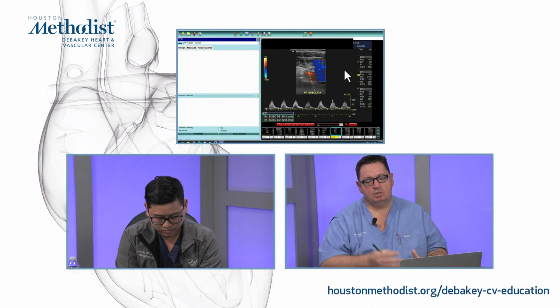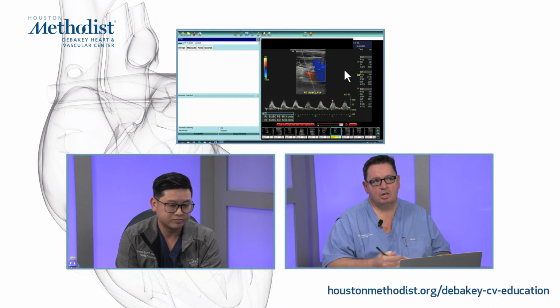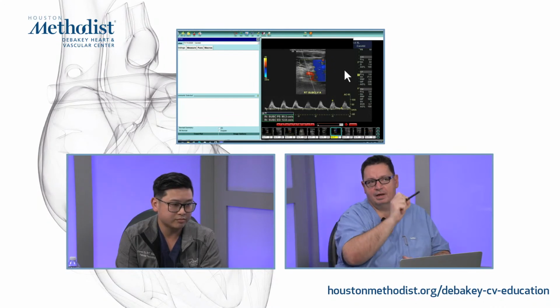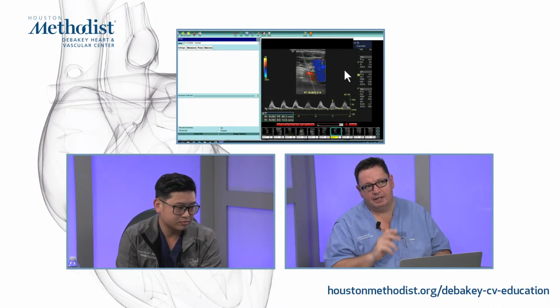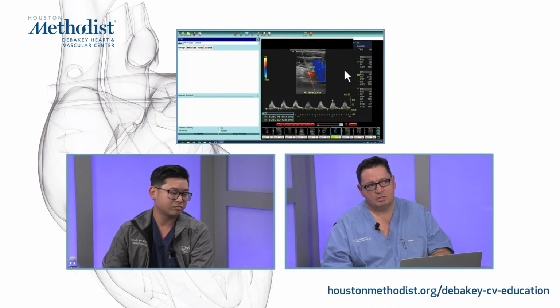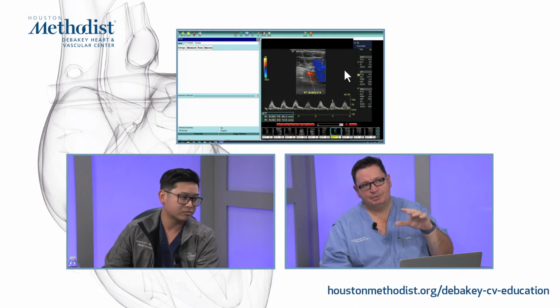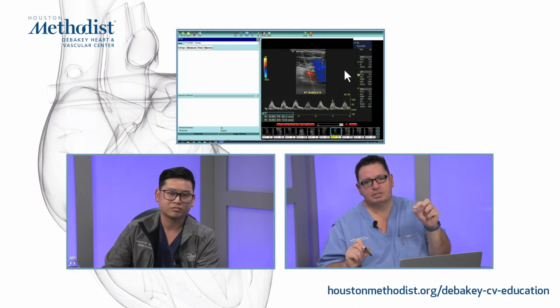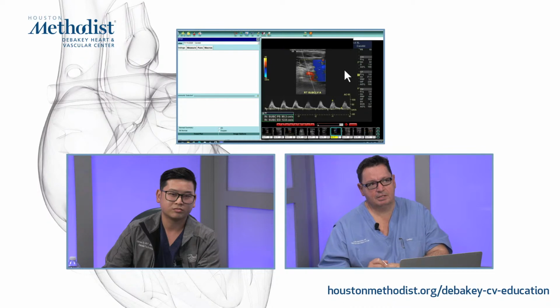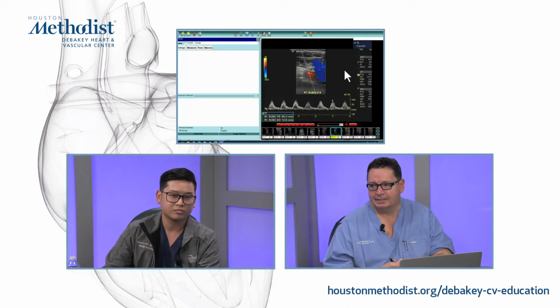Yes. So I think this is where the art of our interpretation and a little bit about the masterclass come in, that you cannot always use a certain criteria of velocity, because you need to go more proximal to really find the increased velocity, because there is definitely a stenosis from this signal. This is our favorite line that you have probably heard all the time: if that systolic upstroke is delayed, then between that measurement point and the heart, somewhere there's a blockage, a hemodynamically significant disease. So this is why we need to go more proximal when you see that abnormal waveform, because you will definitely find that increased velocity.